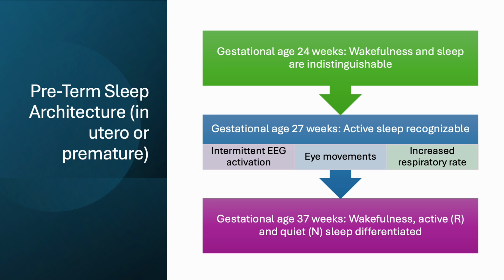Well, we know the answer because we've monitored premature births. There's nothing nice about having a baby in the neonatal intensive care unit, but if there is one convenient thing for technologists in monitoring infants this young, it's that you really don't have to scrub their skin, and they're really not going to move much to be able to take the wires off.